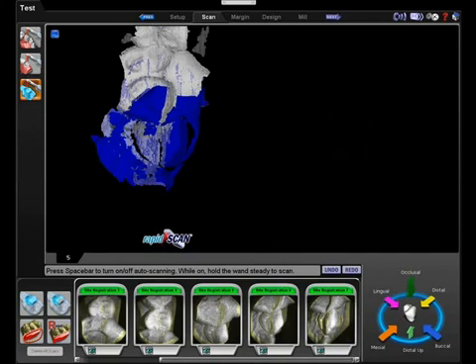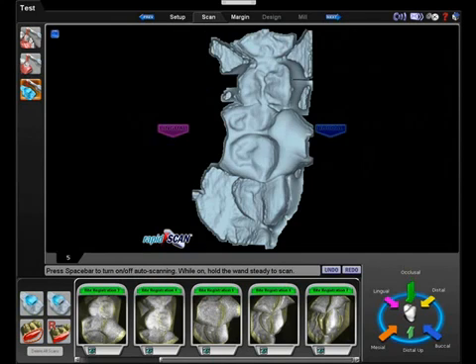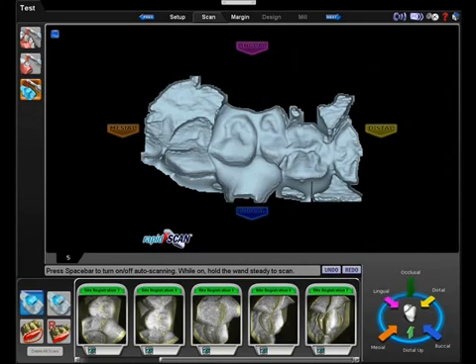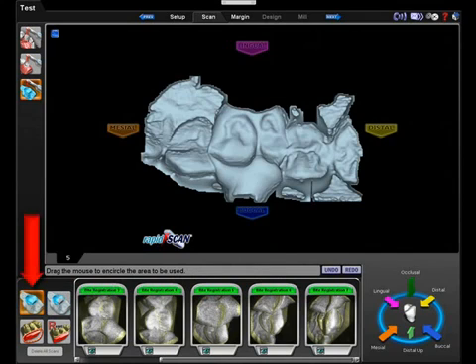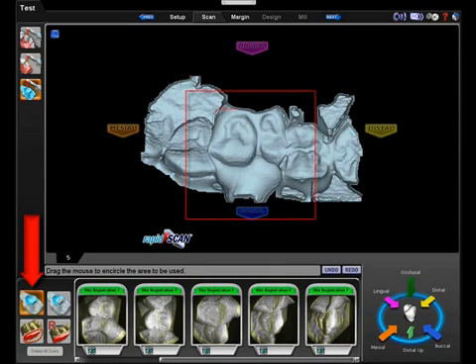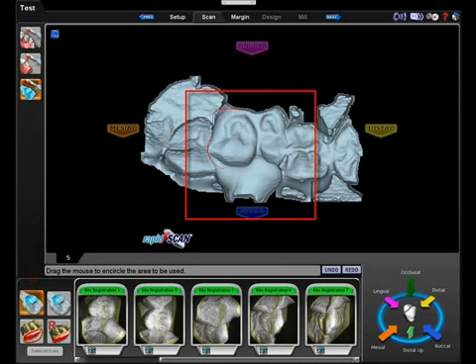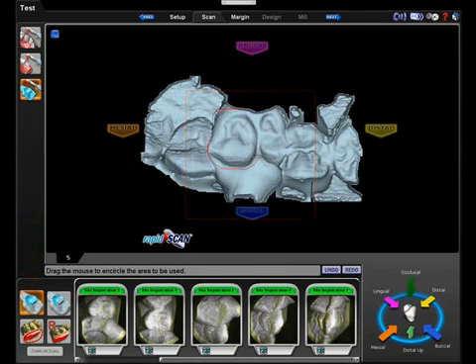As you can see, we only took occlusal shots of the byte registration. Click select byte area and circle the functional portion of the byte registration. We do not want to include any of the non-functional portions.